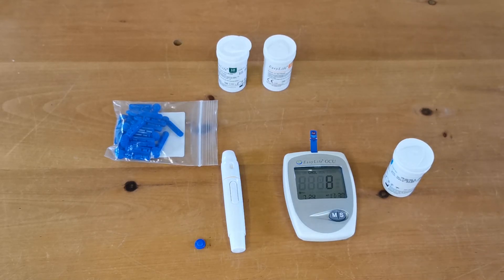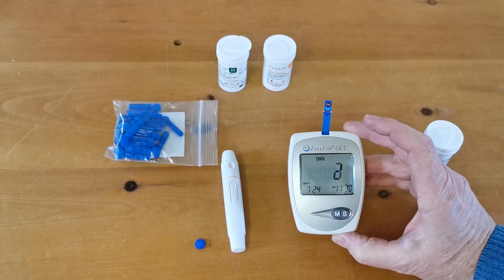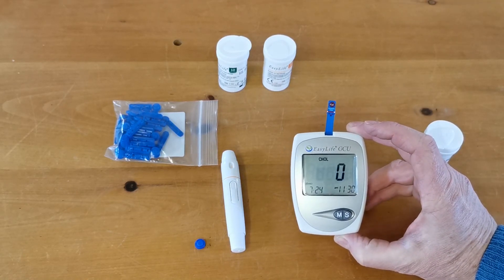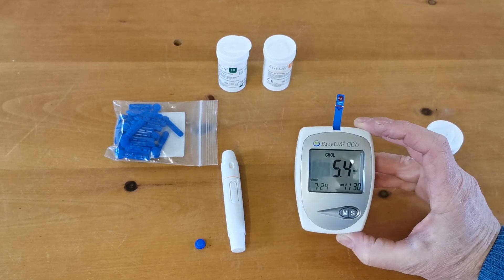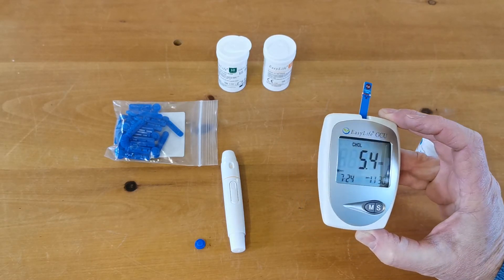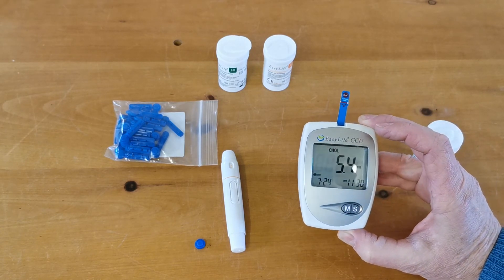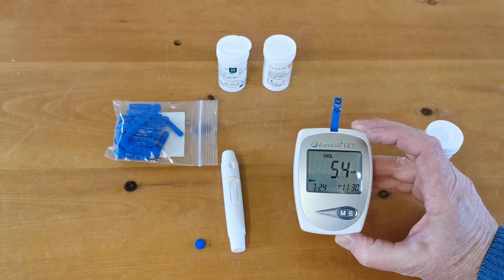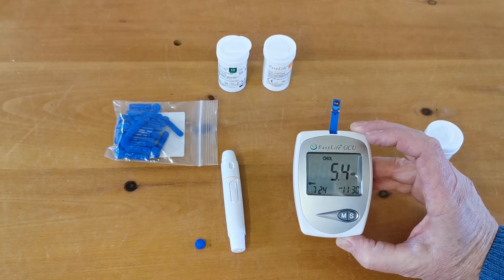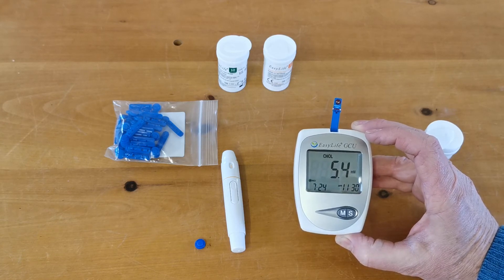This meter is just about ready to give me my cholesterol reading. Three, two, one — there we go: five point four. That is five point four millimoles per litre, which is my real-time blood cholesterol — I think I'm quite pleased about that.